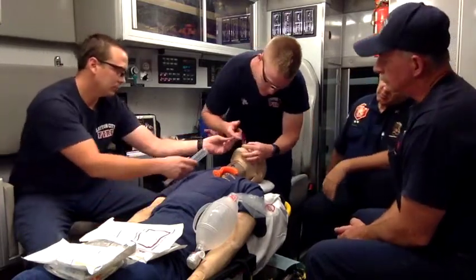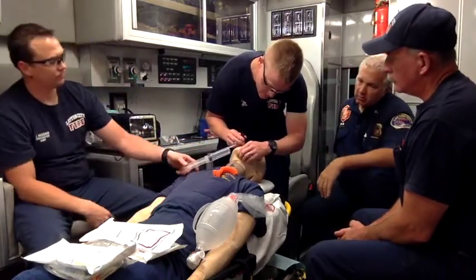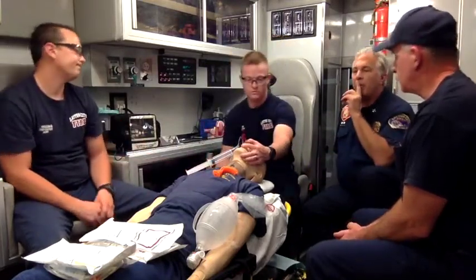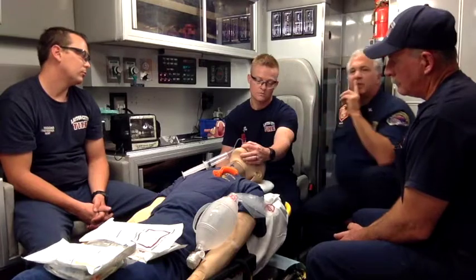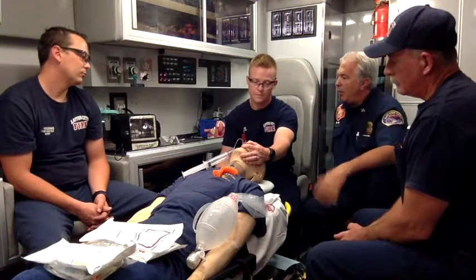And when you say the base, what do you mean the base of this connector? And where does that base of that connector go? To the teeth. Okay, generally, and I know on this mannequin it's hard, but in a real patient, what we want to do is that it'll go to the point where the bottom of that, not this flange that's around the top, but at the bottom where you can see the colors, that's going to be sitting essentially right at the patient's teeth. And I got a picture of it. We'll show everybody.